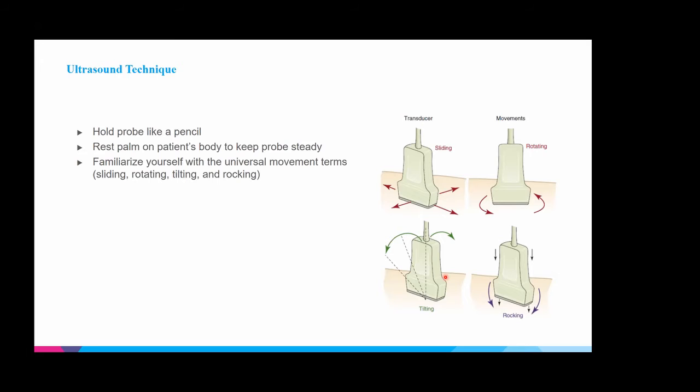The only reason why I mention these terms is because, especially as you get more experience practicing ultrasound and have attendings supervise you, we try to use this universal terminology to help obtain the ideal views. Any questions about these terms?